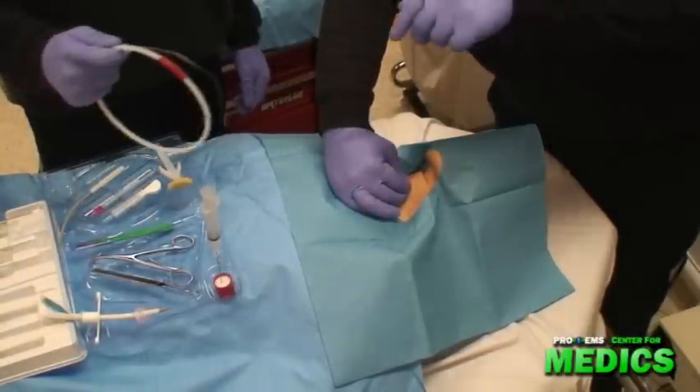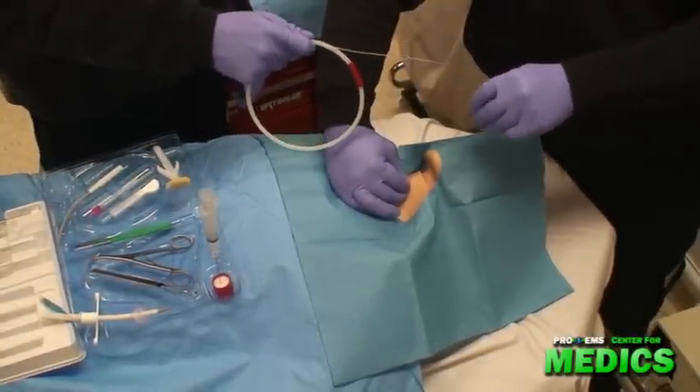Next, I'm going to advance the guide wire through the catheter and into the trachea.